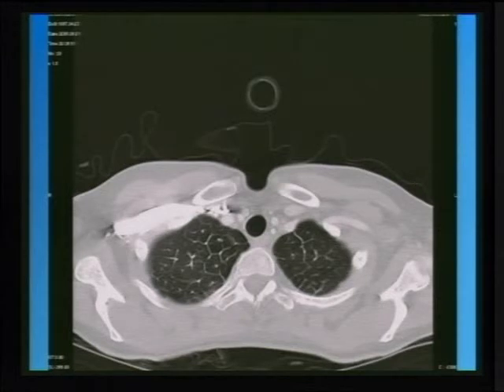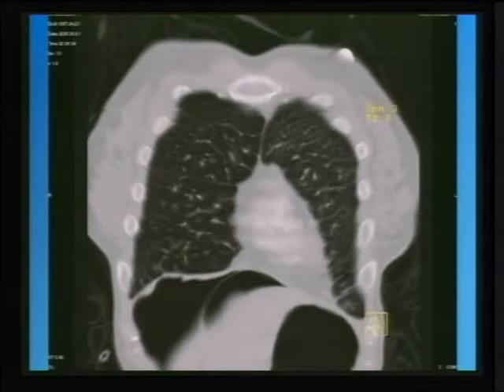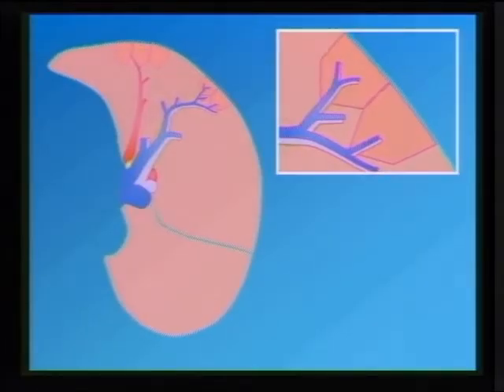We don't typically scan a patient for this entity, but just remember that also other things can happen within interlobular septa. Again, you see this framework of thickened interlobular septa, secondary pulmonary lobule, central arteriole. Now you can easily recognize them. But here, this is not as pronounced and is smoother. This is a patient with just pulmonary edema and early interstitial edema. Again, interstitial edema, you may have fluid going into the veins, but also going within the supporting connective tissue. So the very early changes of interstitial edema will manifest as this thickened interlobular septal thickening.